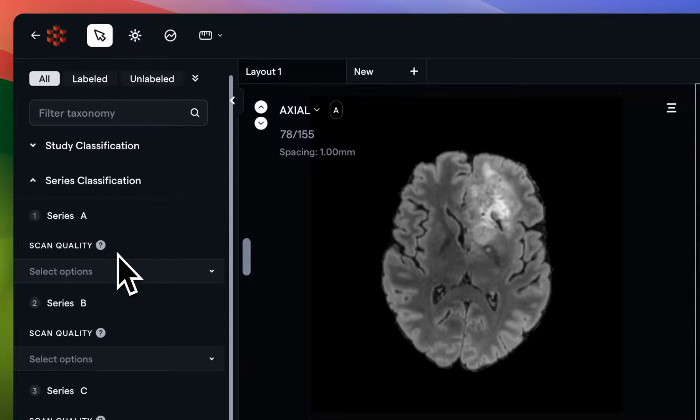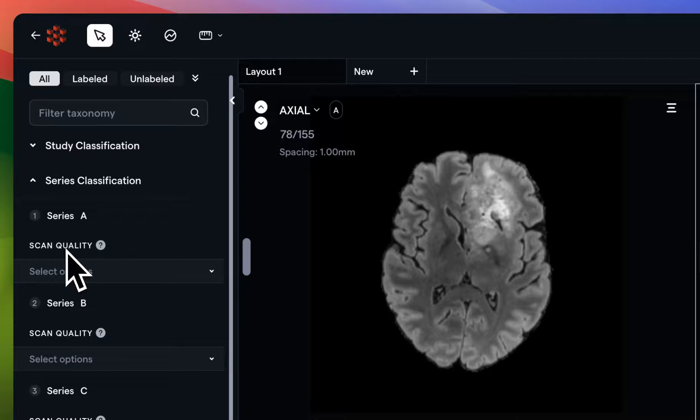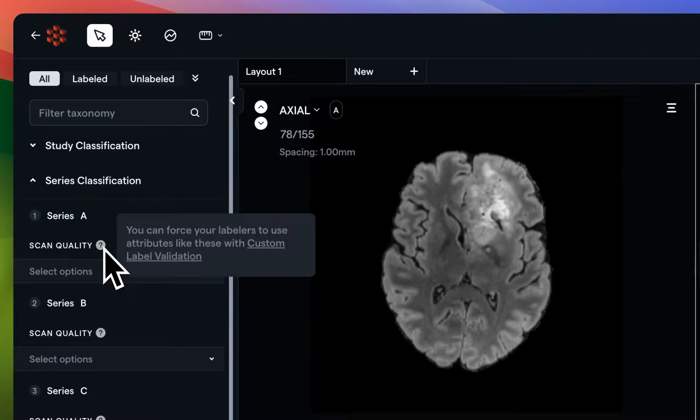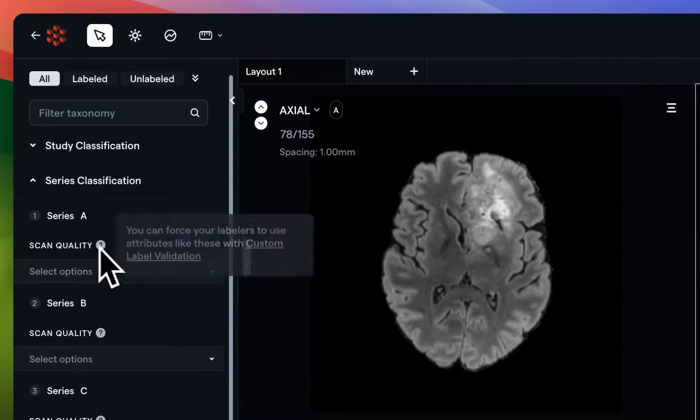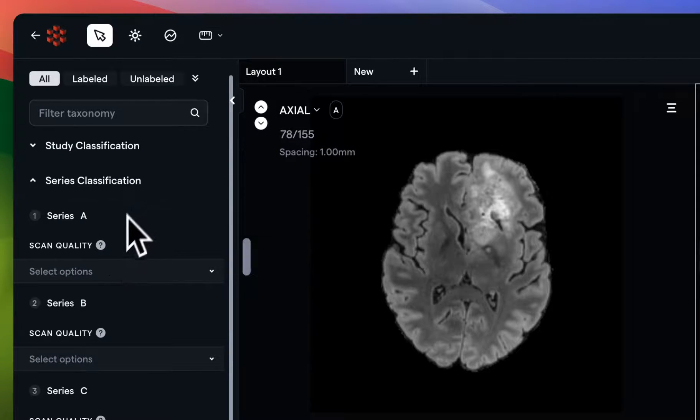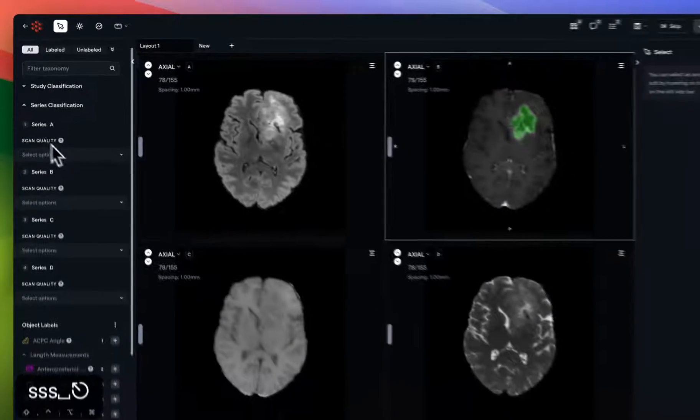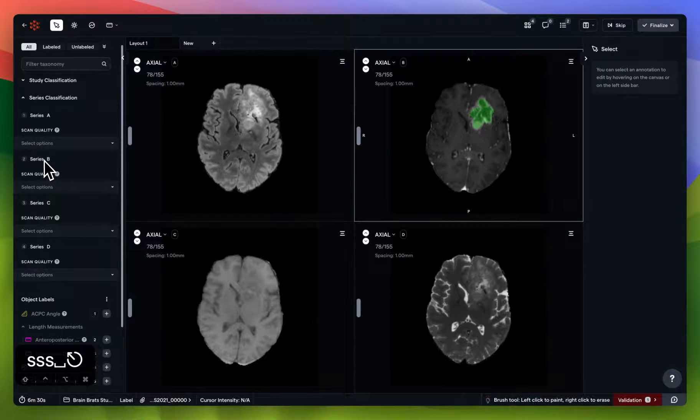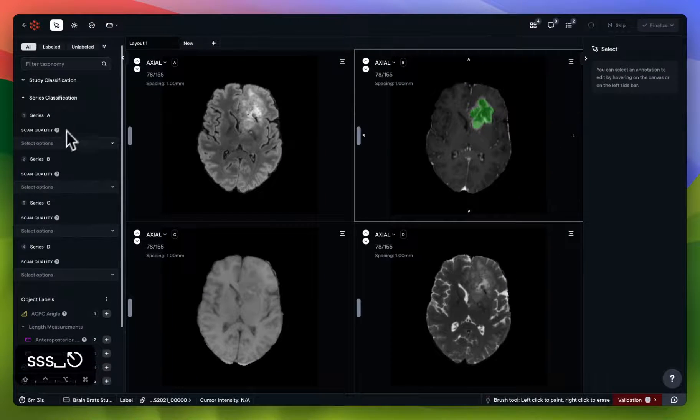You can see in our case, our admin has left us with the task of ascribing scan quality, and maybe left us even with some instructions for this, for each of our series, series A, series B, C, and D. I'm going to do that quickly.